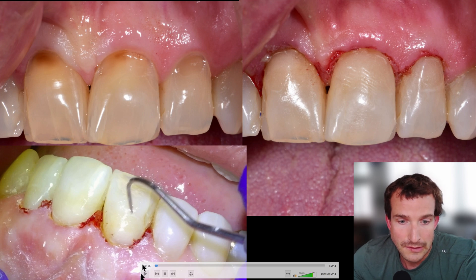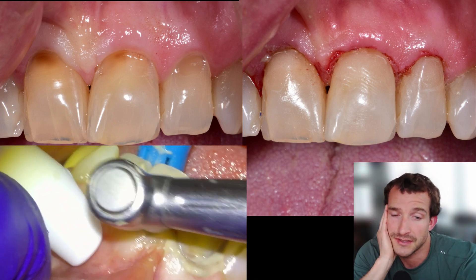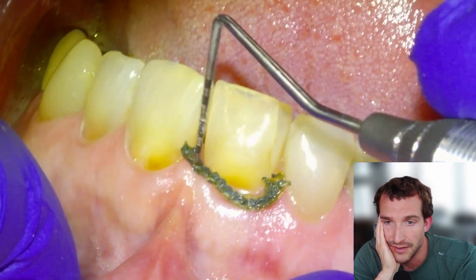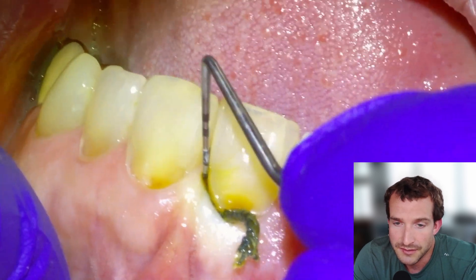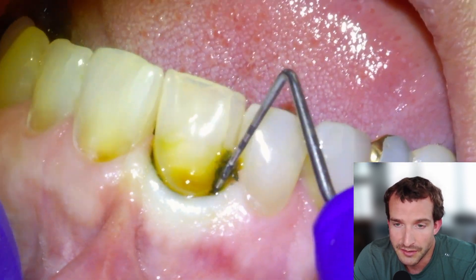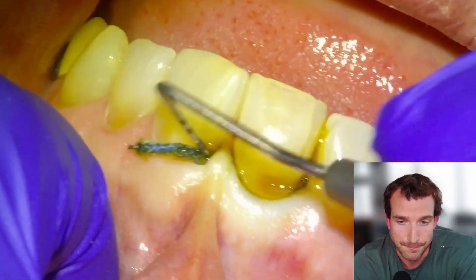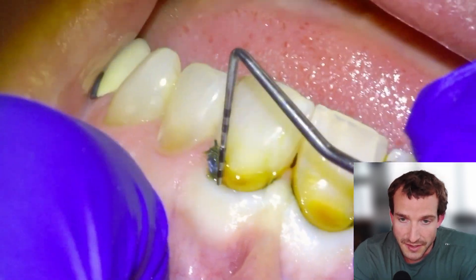So we basically packed some cord, pumiced the surface of the teeth, applied some Fuji 2 light cure, shaped it, and that's how we ended up with the final result. We'll go over the whole procedure step by step. We're going to grab some Ultra Pack size one cord — pretty much the only cord I use — soaked in an astringent, then cut it into a segment about the right length for the buccal surface. We're packing tooth number 11 first. This is an abfraction that I typically tell patients never needs to be restored unless it starts to decay or is very sensitive.